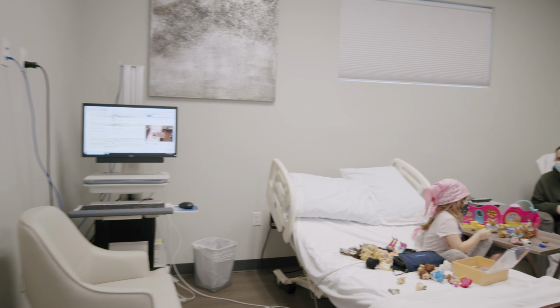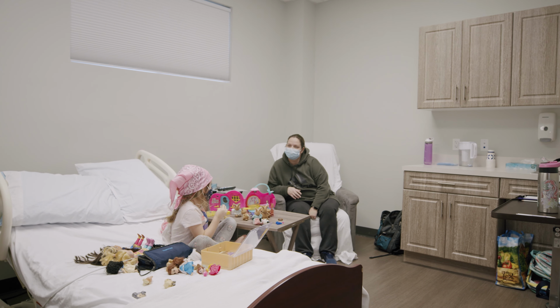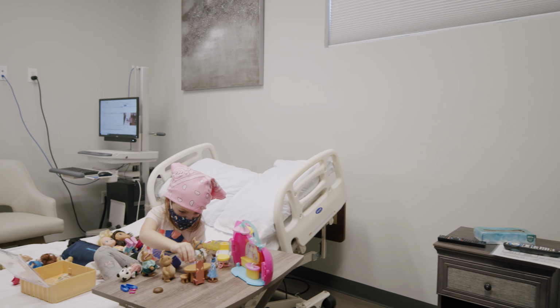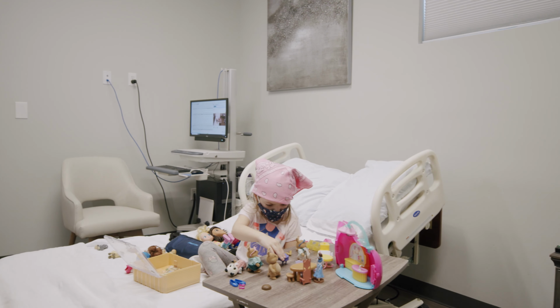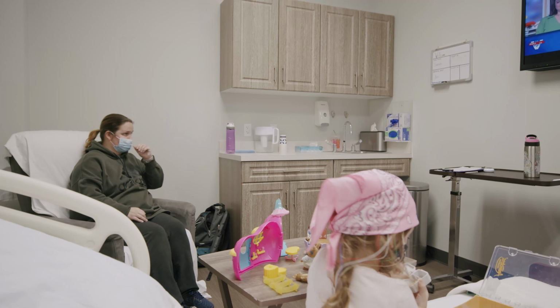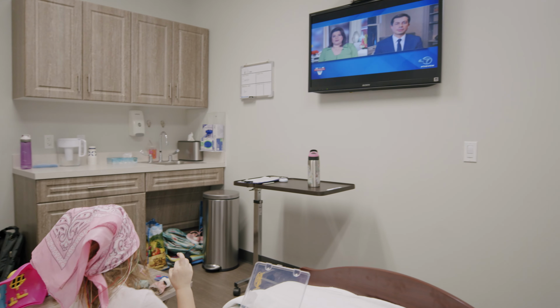Long-term video EEG monitoring is a test where we measure your head, clean the scalp, and use a medical glue to apply the electrodes to the scalp so that they remain on for a longer period of time, minimum 12 hours, sometimes up to 3 days, depending on what your doctor orders.